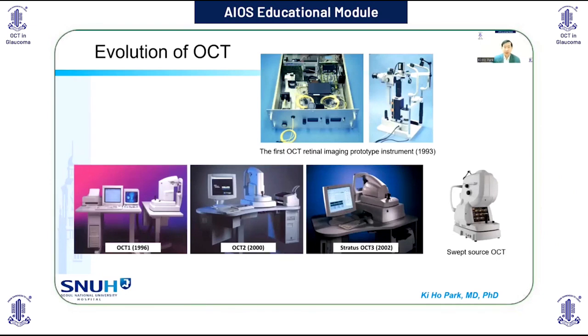About 30 years ago, the first OCT prototype was invented, and the OCT has developed very fast. Now we have spectral domain OCT and swept source OCT as well.